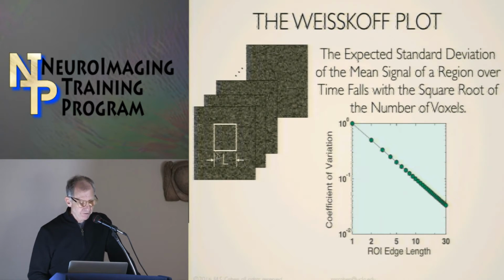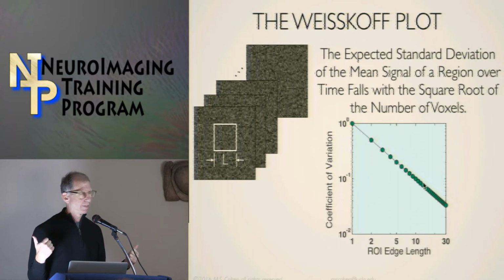So if you measure now the box length, just the length of any of its sides, the signal noise ratio should be directly proportional to the side length, right? Because it's proportional to the square of the side length on the averaging, if that makes sense. I'm sort of confusing the way I'm stating it, but it's a relatively simple concept. So the expected variation should fall as the box becomes larger. Okay, linearly as length becomes larger, the signal variation should fall.